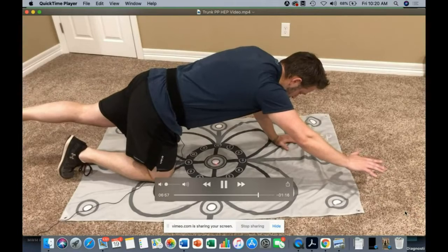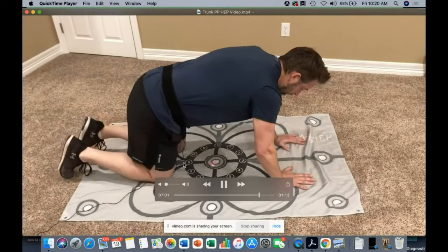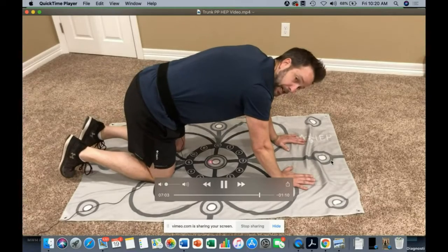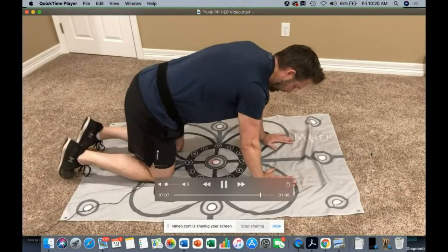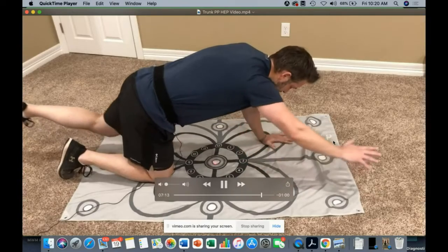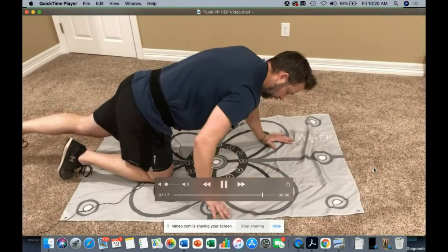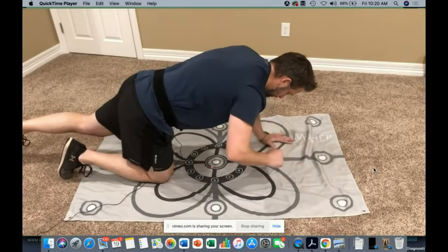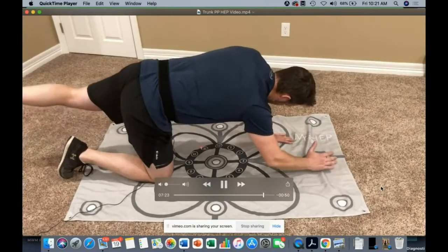Or have them start crawling. This is a great pediatric activity if you're working with any pediatrics. Having them crawl while keeping the laser on a line, even if it's a line that you made with tape on the ground or on the carpet in your clinic, and making that engaged, or having them move the laser side to side as they go through the particular activity, really driving some midline cerebellar for posture activities.